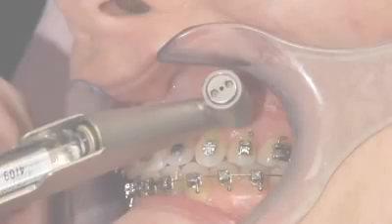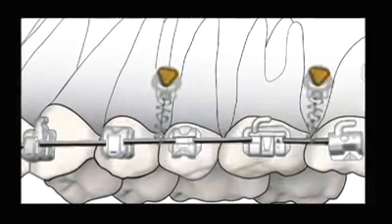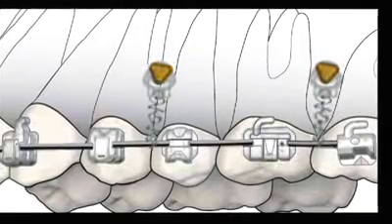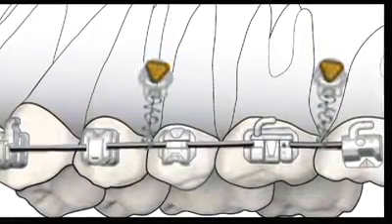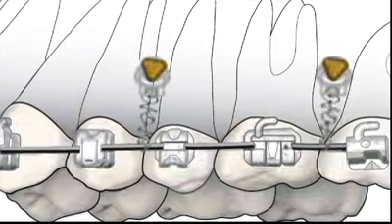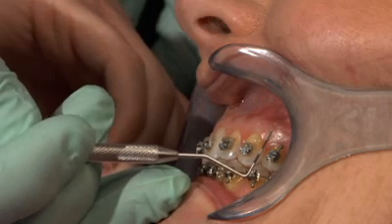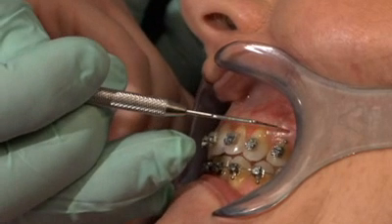At this point, you're ready to place the mini-screw. Some occlusal cant cases may require up to two 8mm mini-screws placed between the 1st and 2nd bicuspids and between the 1st and 2nd molars. But treatment of this case will require just one 8mm mini-screw placed distal to the cuspid.